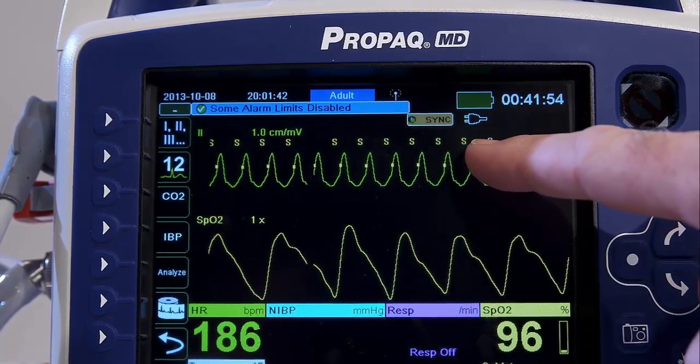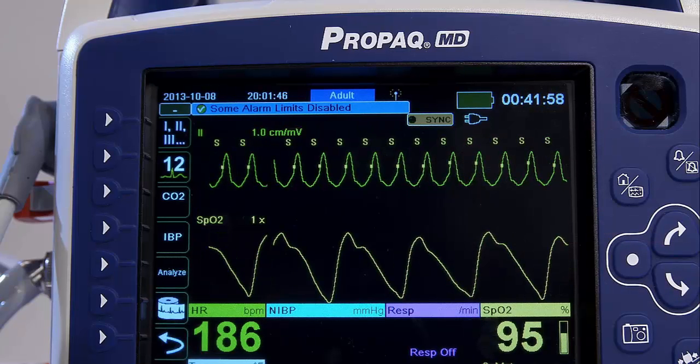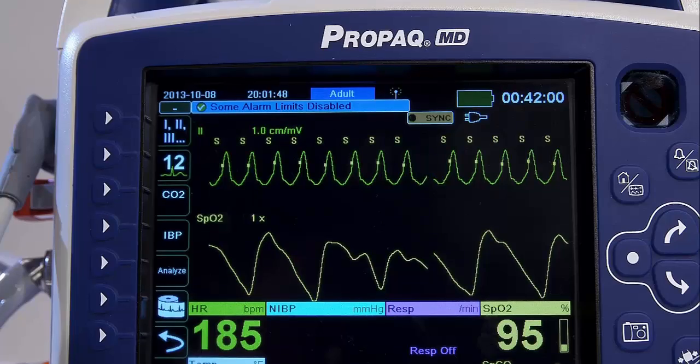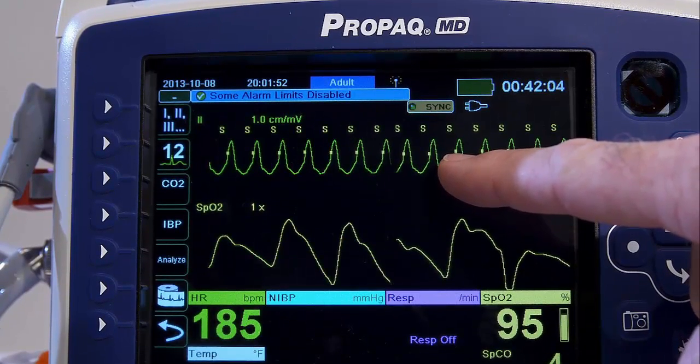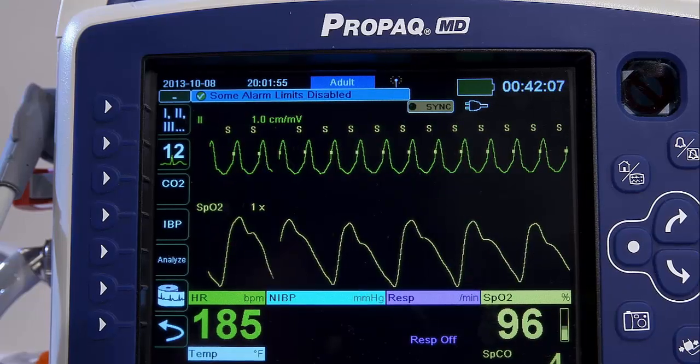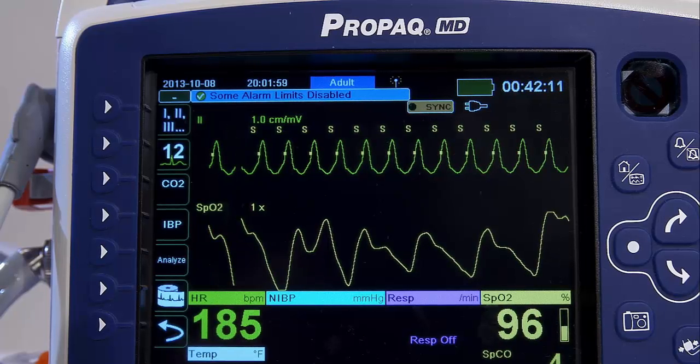The yellow dot is the R-wave indicator, which appears on the R-wave to identify where the shock will be delivered. The R-wave indicator may appear anywhere on the R-wave, not necessarily the top. It may appear at the peak, the base, or anywhere in between.